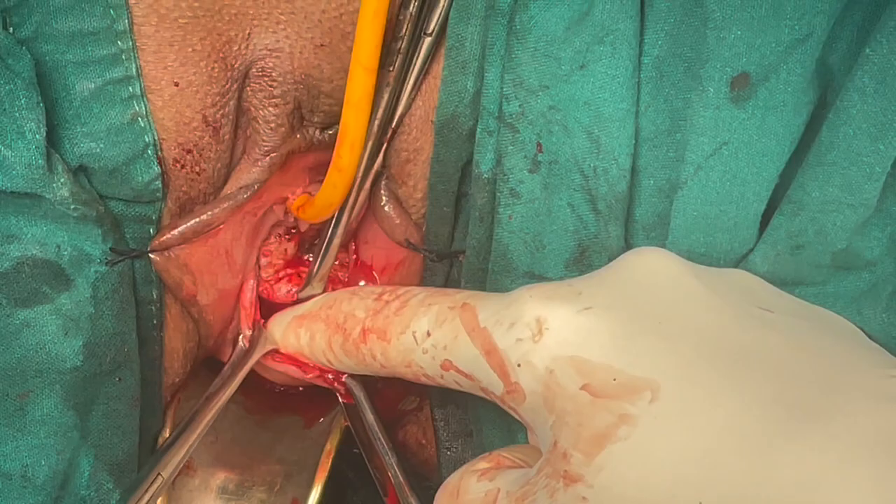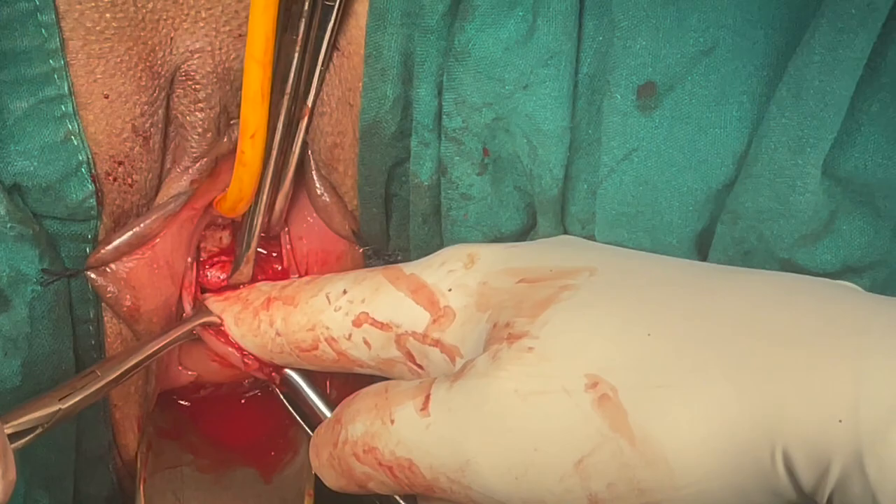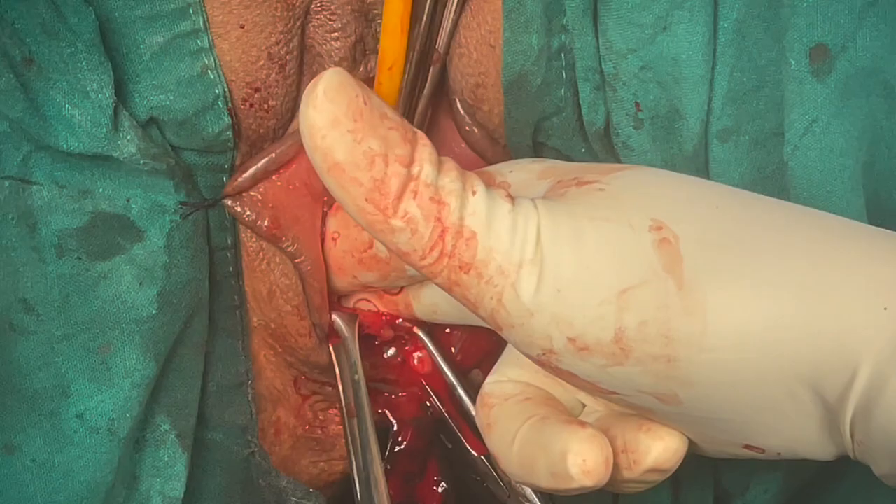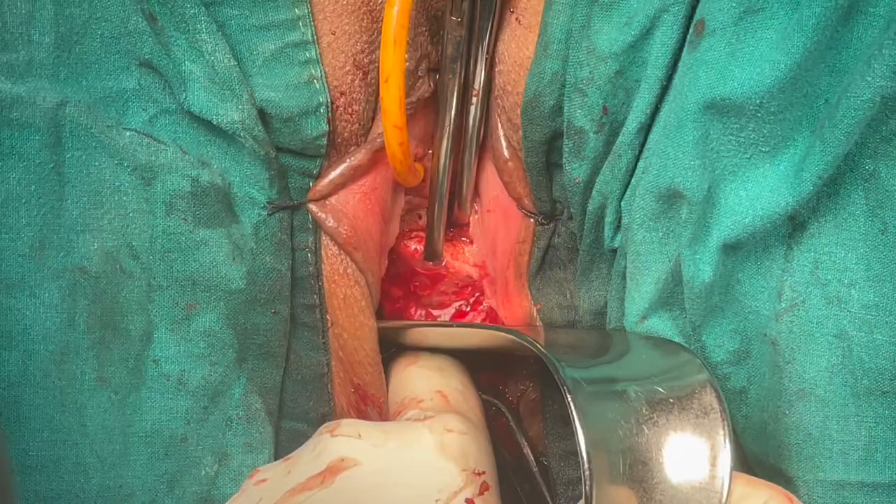For sacrospinous ligament fixation we start dissecting on the posterior aspect of the vaginal wall until we feel the ischial spine. Once we have felt it, start rolling your fingers from lateral to medial in order to create the space.